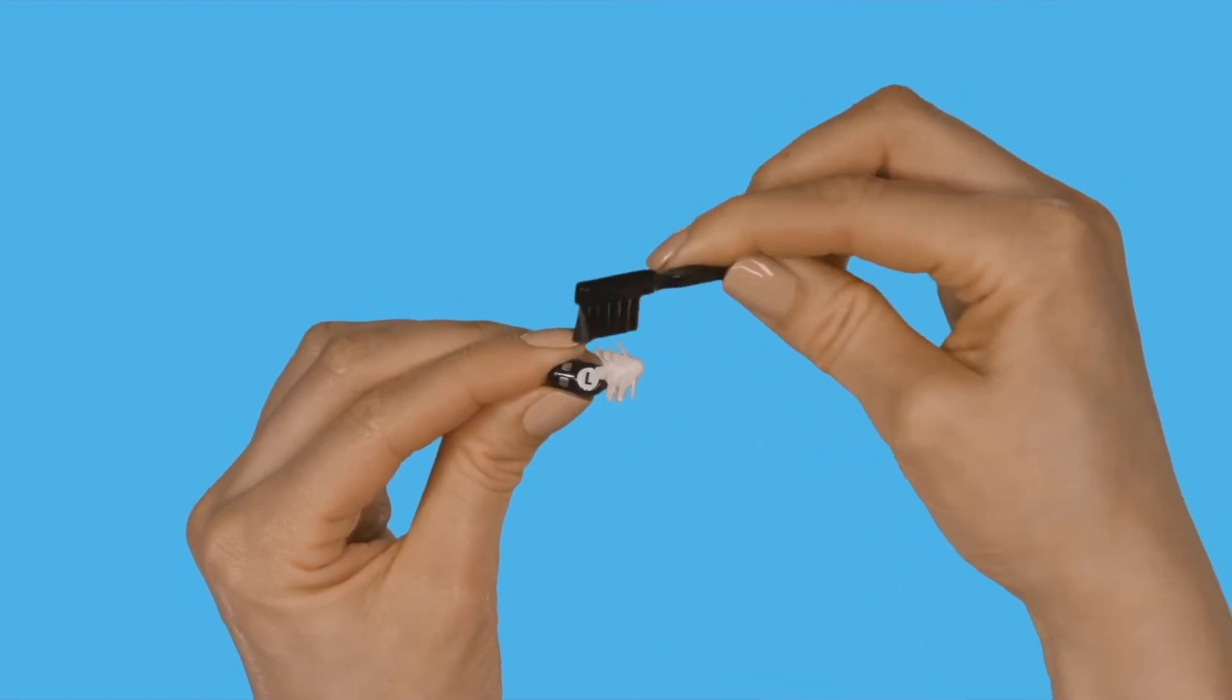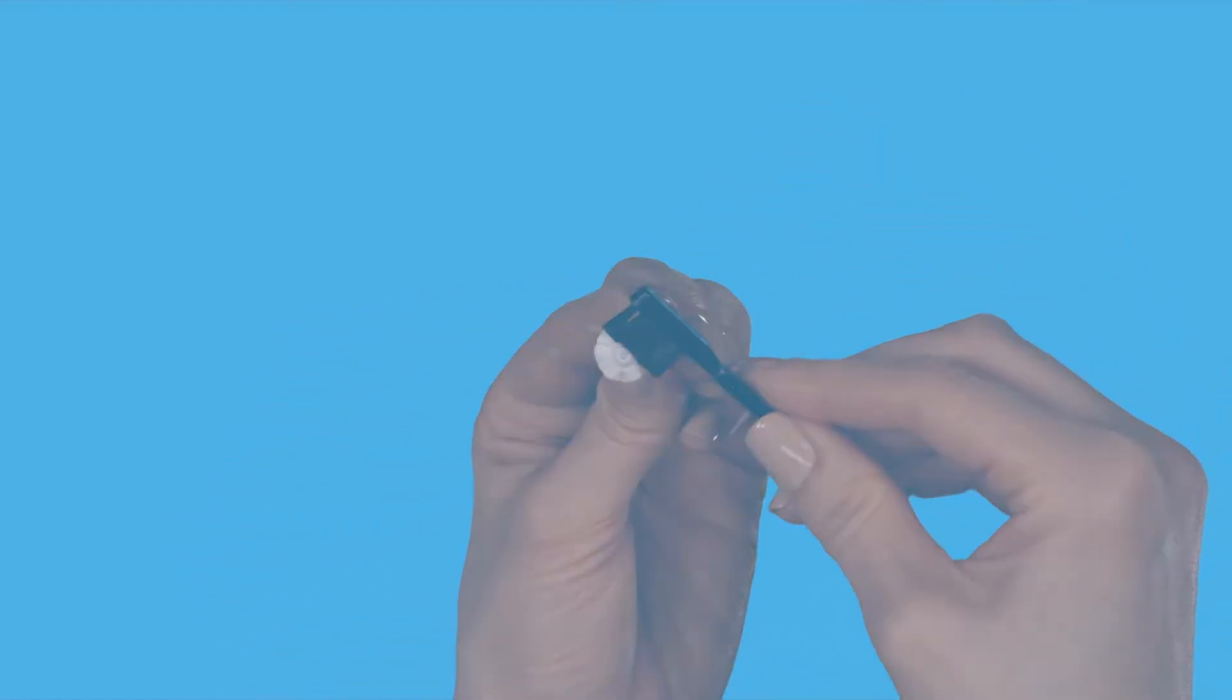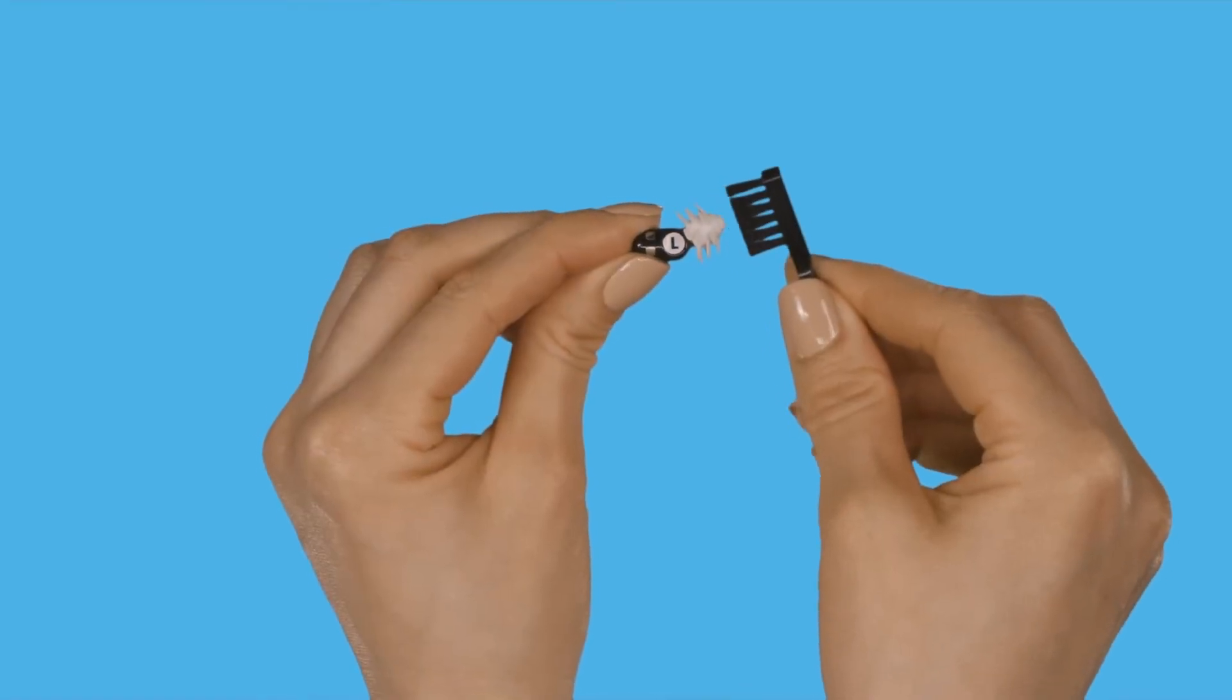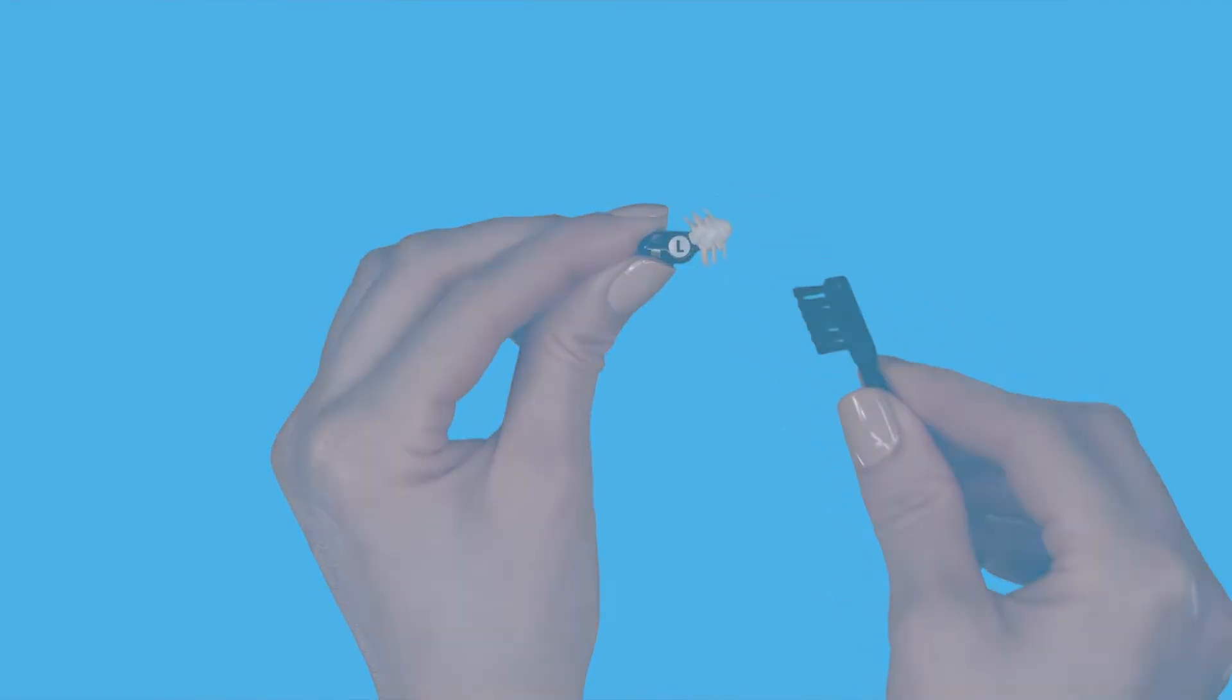If you notice wax or other debris on your flexis, simply let them dry and gently clean them with the cleaning brush provided in the Eargo box.